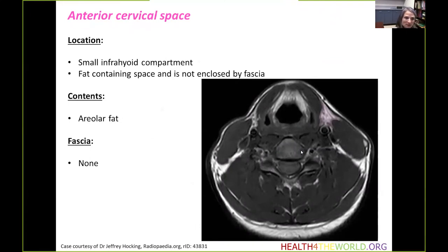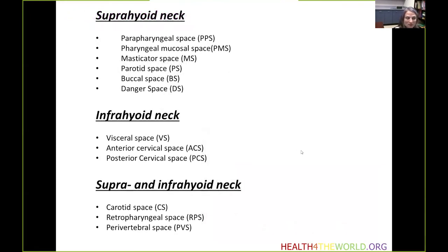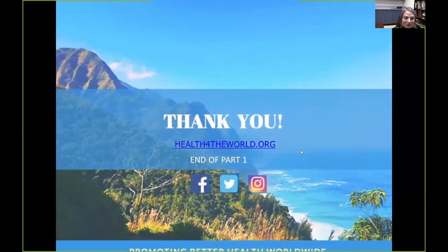The final space is the anterior cervical space — a small infrahyoid compartment that contains fat and is not enclosed by fascia. To review: we looked at the suprahyoid neck containing parapharyngeal, pharyngeal mucosal, masticator, parotid, buccal, and danger spaces. We moved on to the infrahyoid neck looking at the visceral, anterior, and posterior cervical spaces. And we also looked at spaces that traverse both the infrahyoid and suprahyoid neck, including the carotid space, retropharyngeal space, and perivertebral space. Thank you very much.